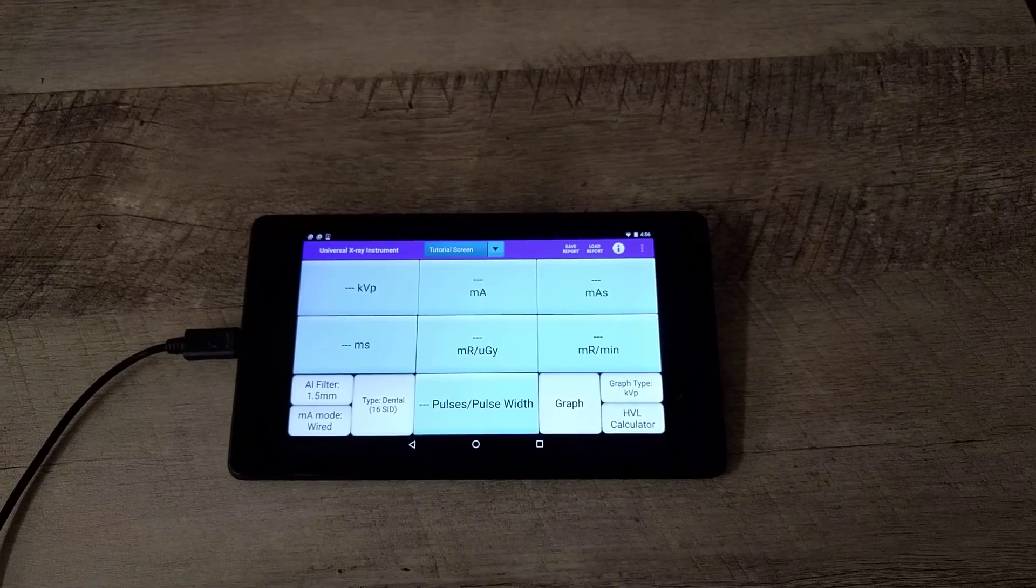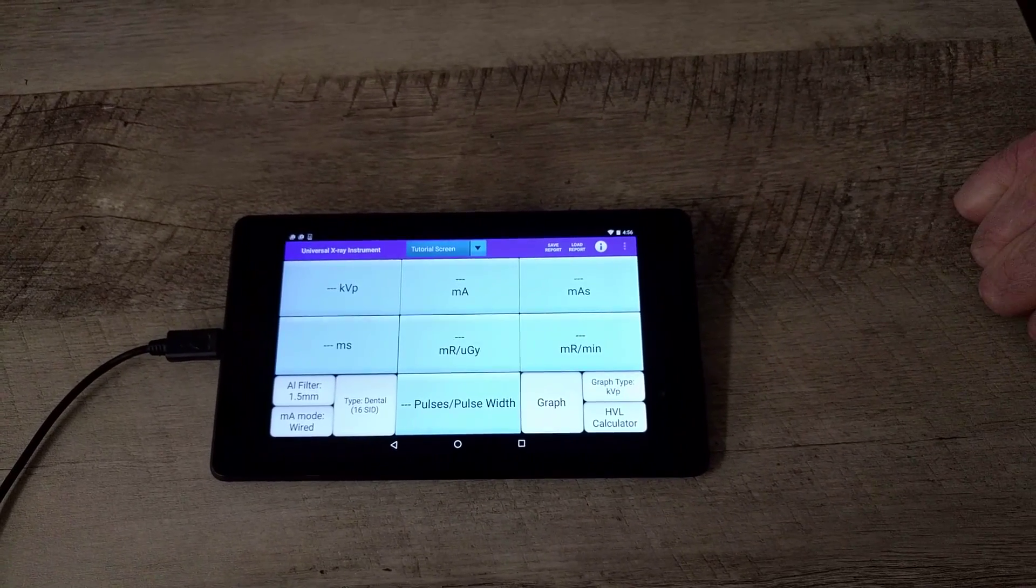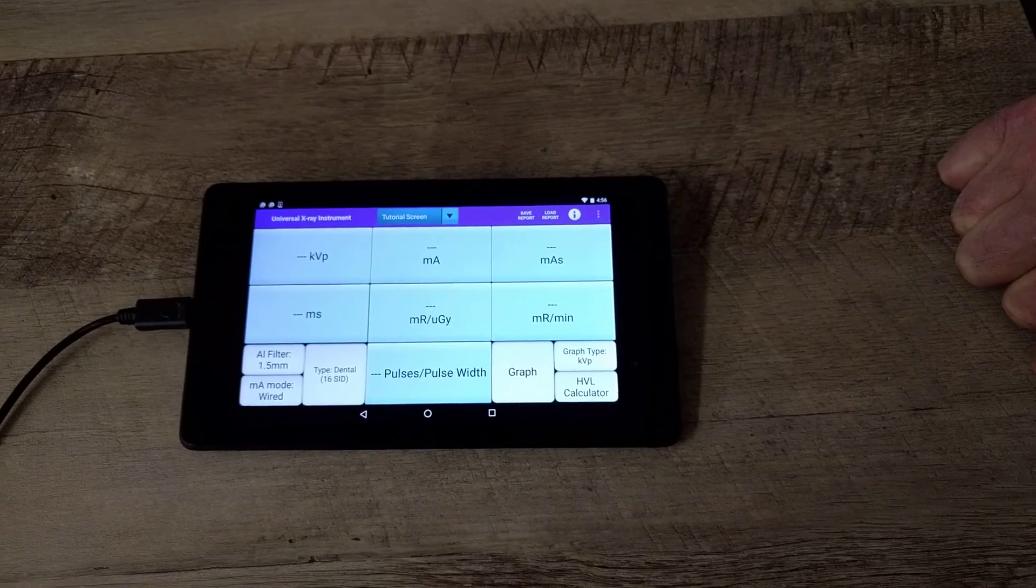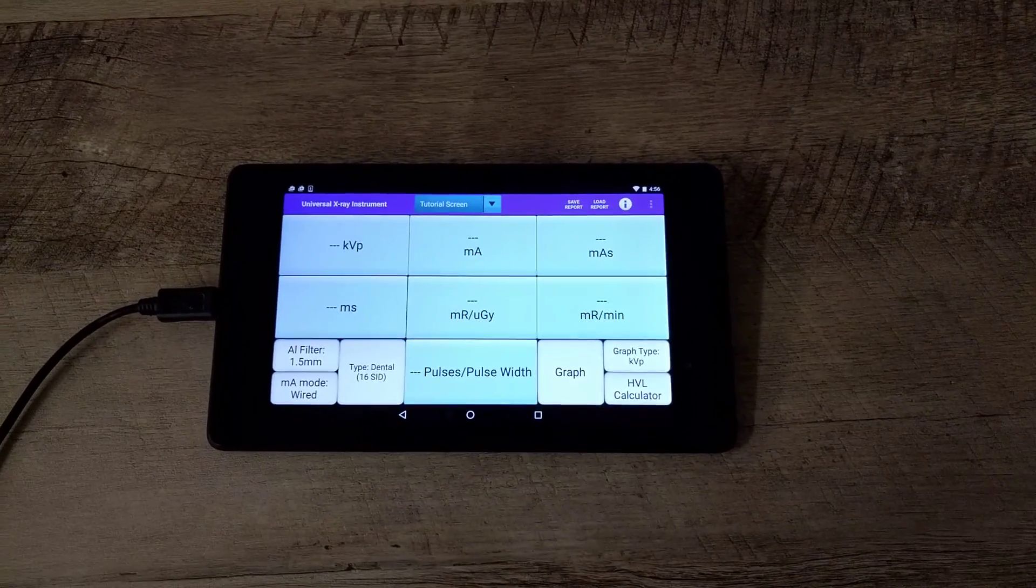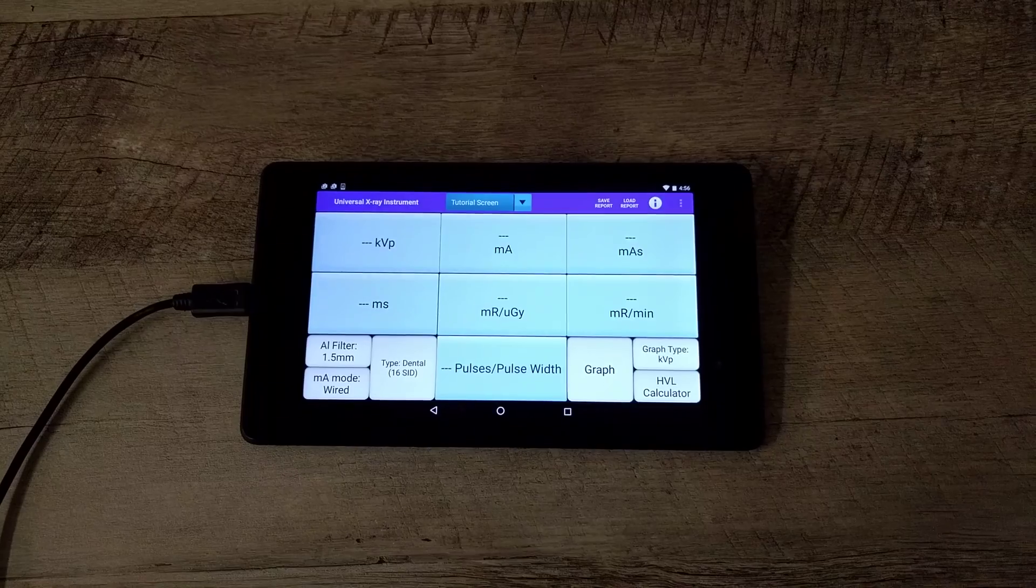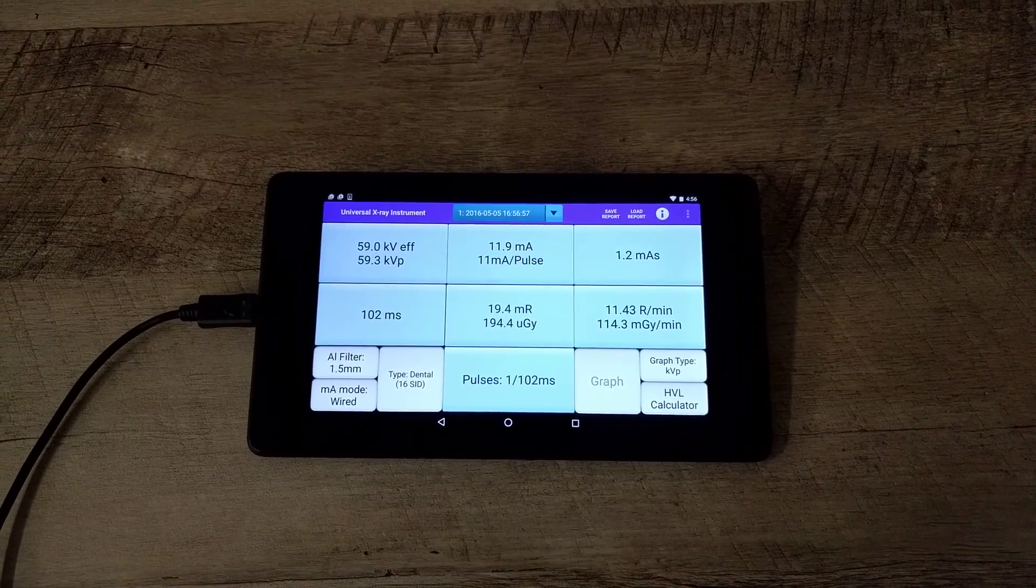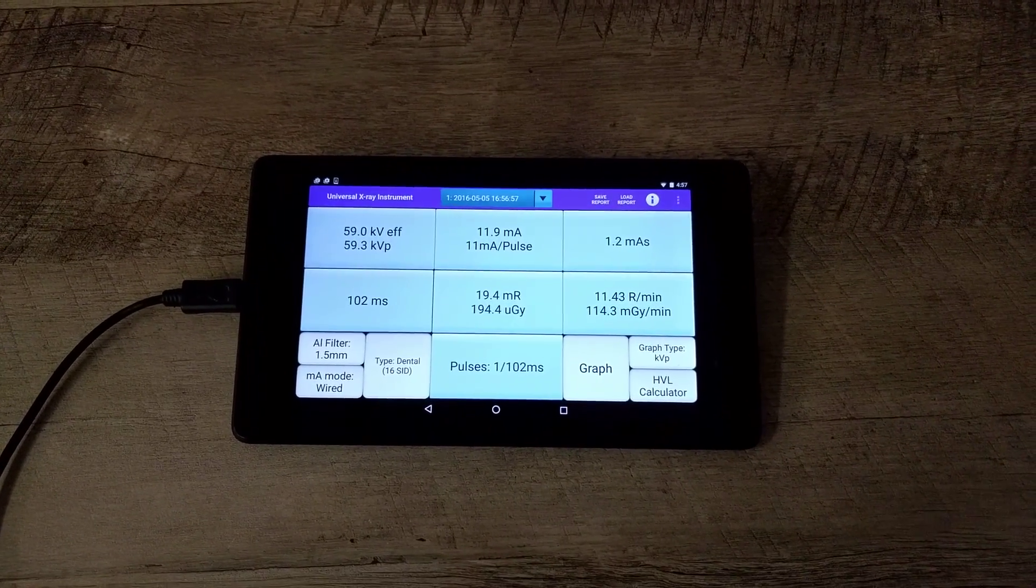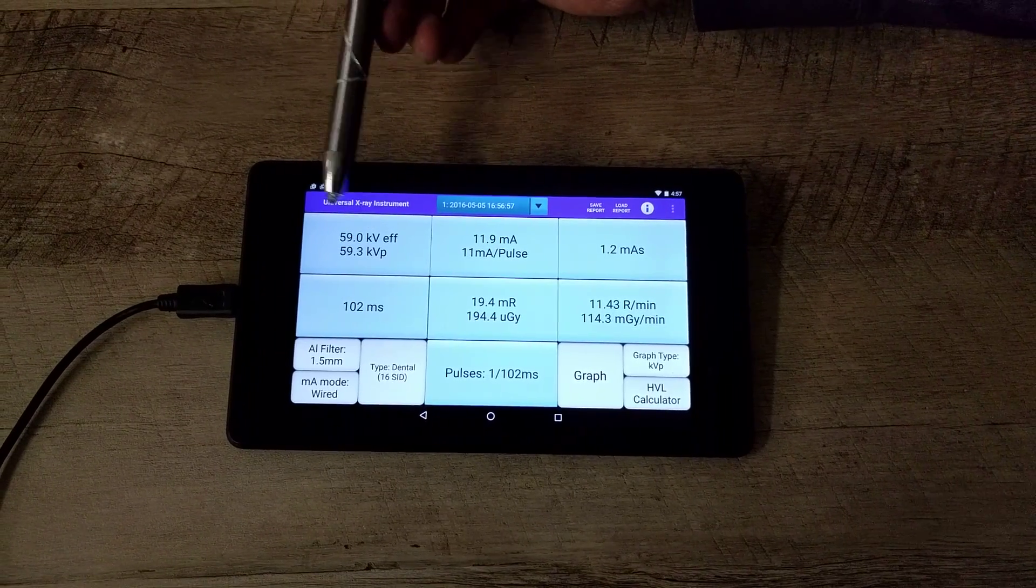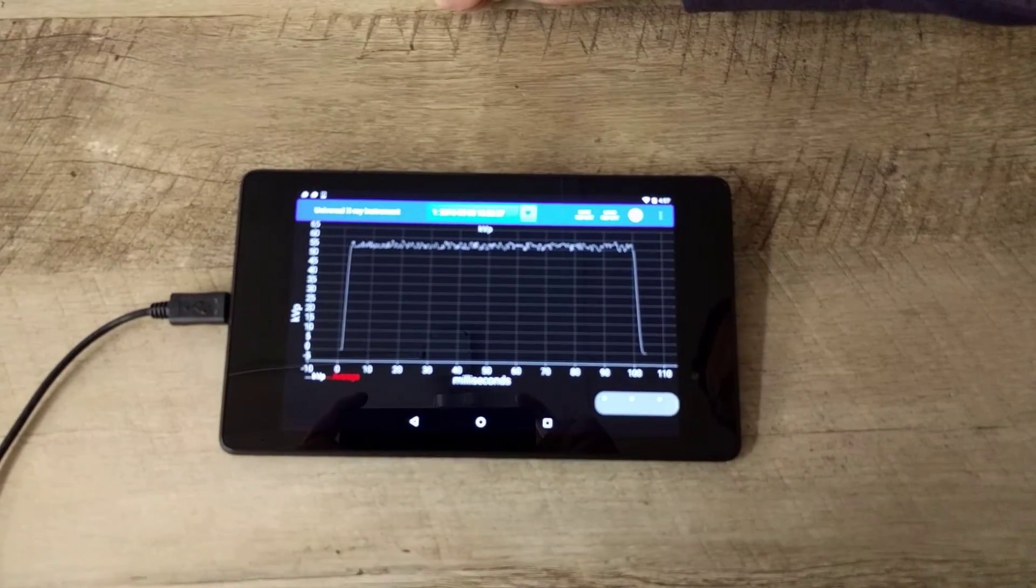We have our X-ray set at 60 kV and 12 and a half milliamps, so we will take an exposure. So here is our readings. We have 59 kV effective, 59.3 peak.